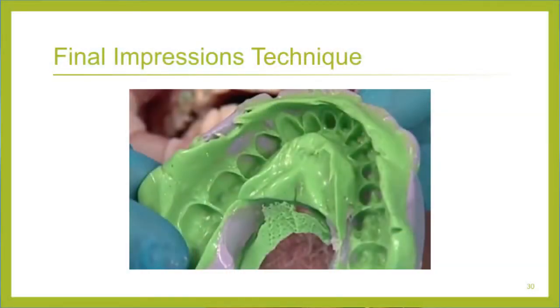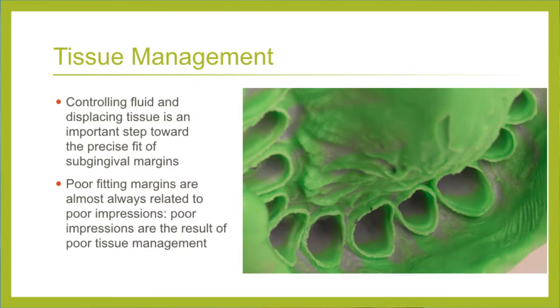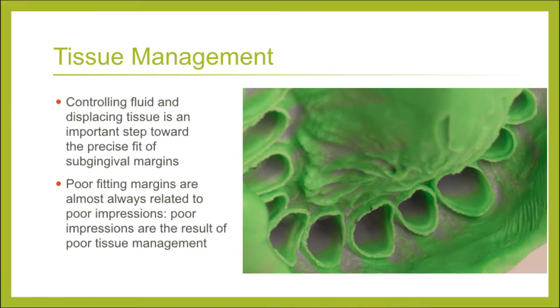I love that. Now let's talk about the final impression technique, because it's something that we really need to focus on. When we think about control, we think about what we are needing. This is the most incredible final impression that I've ever seen. We captured all the dentition. You want to see that sharp, smooth margin all the way around every tooth. We have to have that.